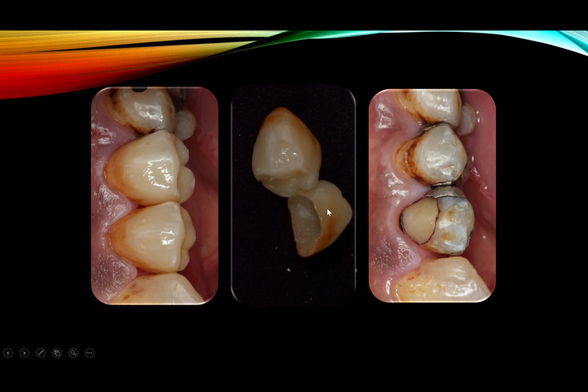In this case, it was a lithium disilicate, fully pressed, low translucent ingot, and staining only. Zero porcelain. All right.